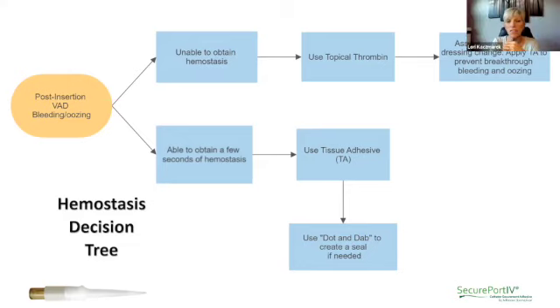Your sterile gauze, I've not heard that that's an issue or a retention of that, because first of all, the gauze that you have in your kit should be a reduced lint, or non-fraying type of fabric. The glue, when you're doing that dabbing and dotting, is still liquid and you're taking that off liquid. I've honestly not looked microscopically to see. I would think it would be no different if you're putting gauze on that site and taking that gauze away from that bloody site, even without glue, that you potentially have some fiber there, because the blood is still very sticky and tacky. So you have that potential there, probably no different than glue.